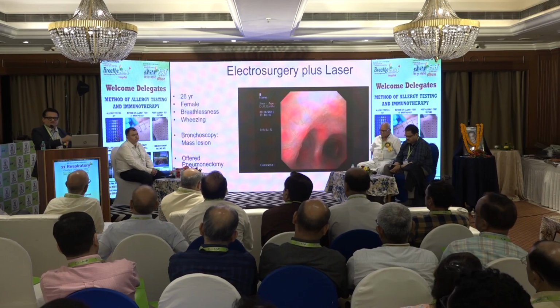And here you can see this was removed. I moved this forward in the interest of time. Oops, it doesn't work. It doesn't like that I move it. Never mind. So in the interest of time, you can use electrosurgery.